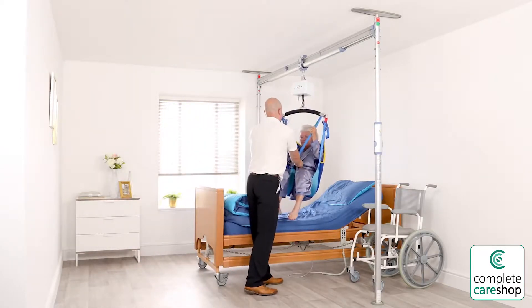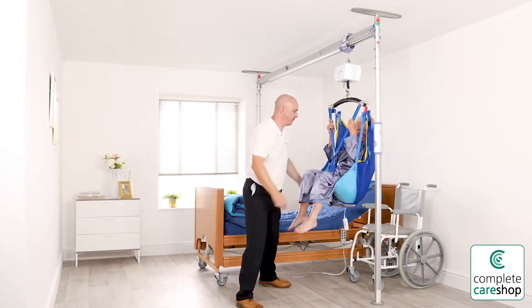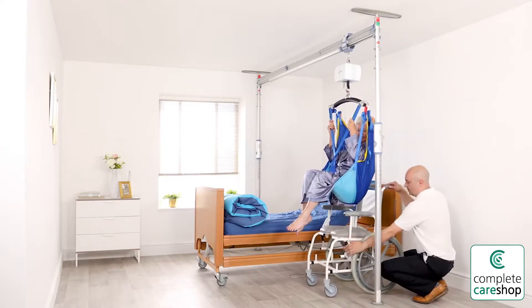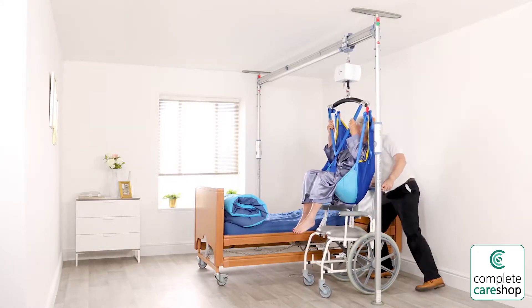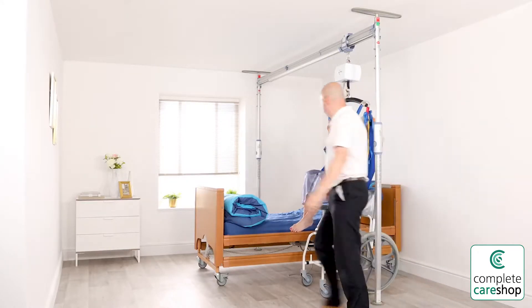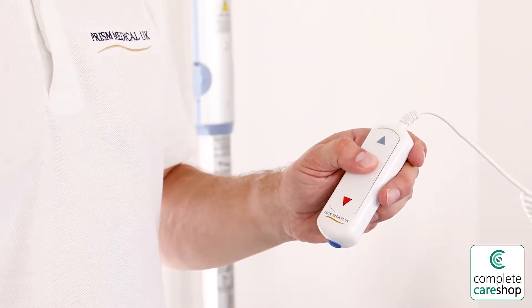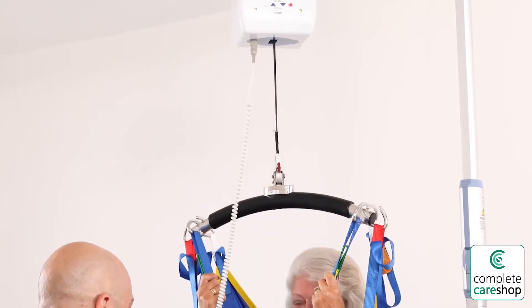It's a cost-effective solution that is simple to assemble without the need for tools. It has a safe working load of 200 kilos, which is approximately 31 and a half stones or 440 pounds, and caters for the requirements of both patient and caregiver, providing a safe and dignified experience for both.